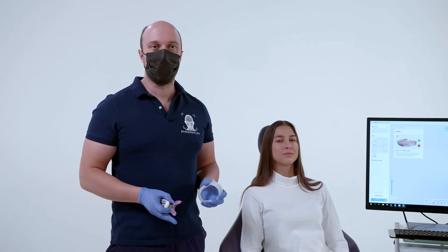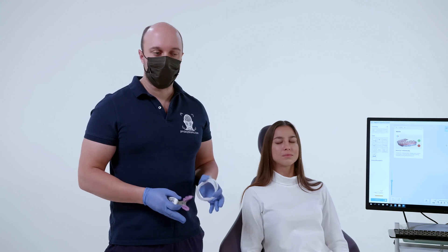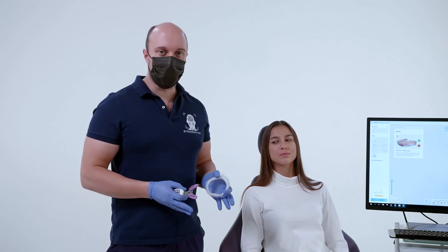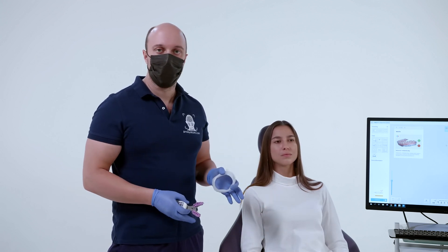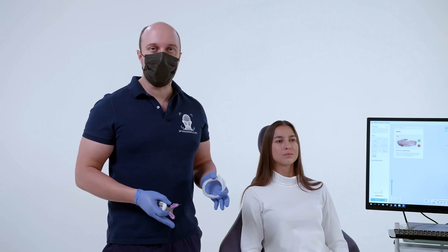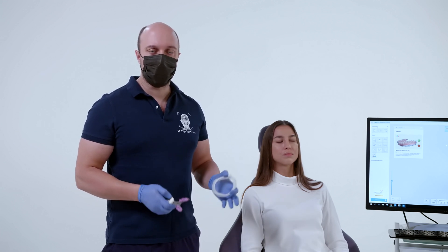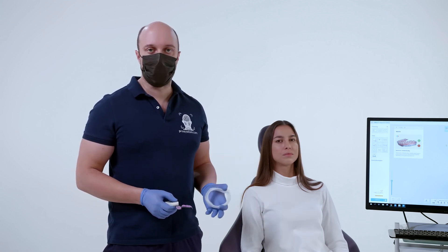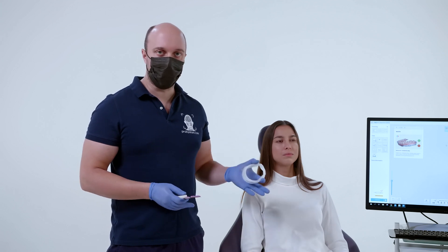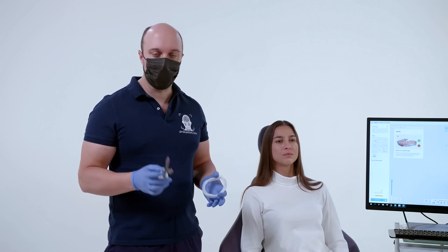We have data on the position of the upper jaw in space. Next, we need to get information about virtual models that digitize the data on the dentitions. For this, it is possible to use an intraoral scanner, or we can take dental casts, make plaster models, and then use a lab scanner to digitize the models.